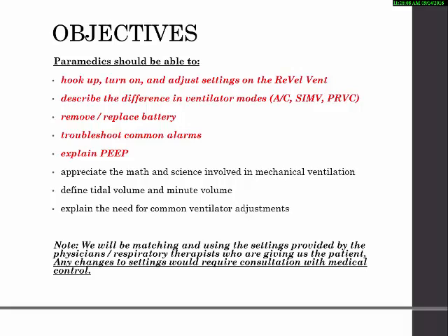Please note, we're going to be matching the settings on our ventilator to the settings on the ventilator at the hospital when we get there. So when we switch our patients over, we're just matching settings. Any changes that we're going to make to those settings would require consultation with med control. So we're not going to be doing any changes on our own. This is simply us mimicking what the vent at the hospital has on it and going with that.